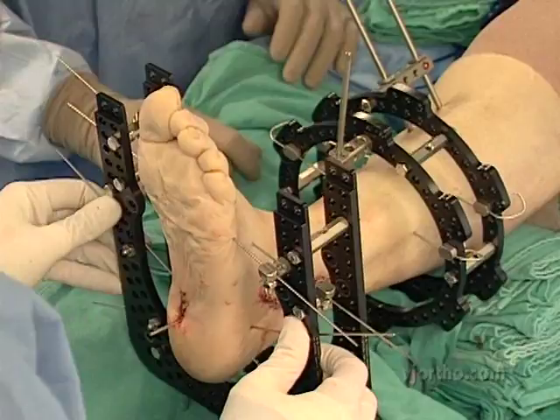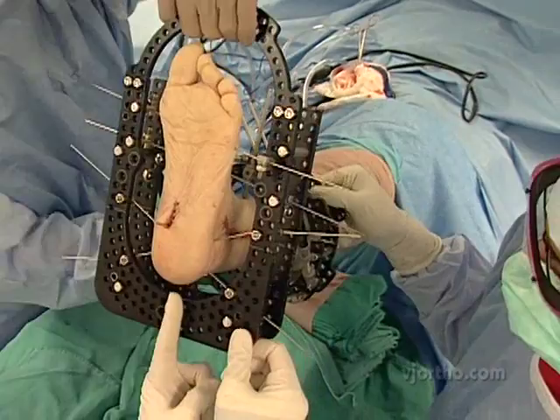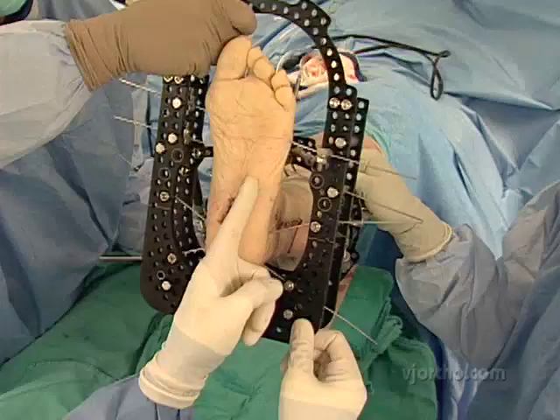You can see this here — what we're going to do is try to drive this right down. I could aim just slightly lateral and maybe get more of the calcaneus that way, but I like a half pin in the heel. I want to go right down the axis of the calcaneus with this.